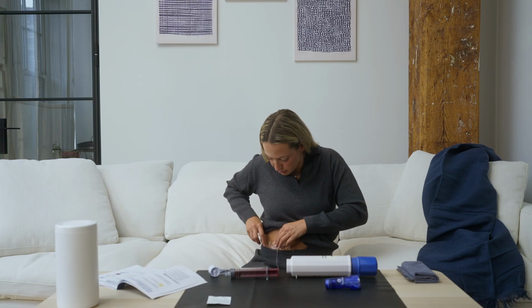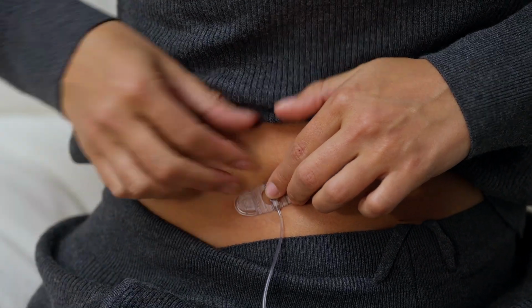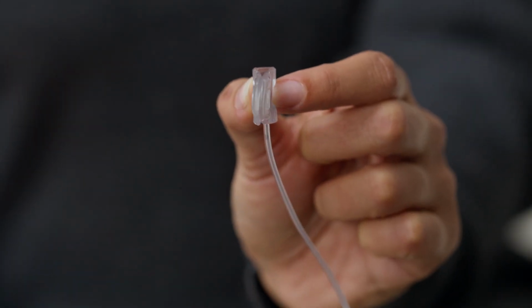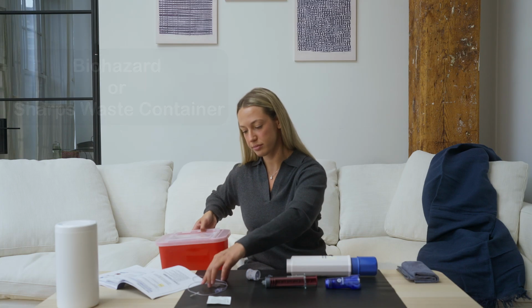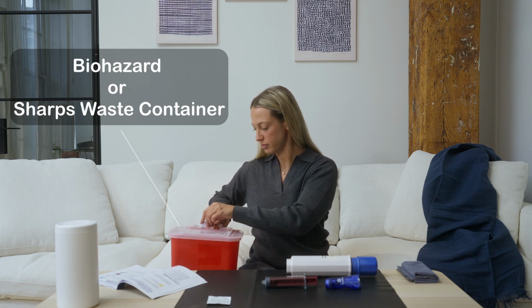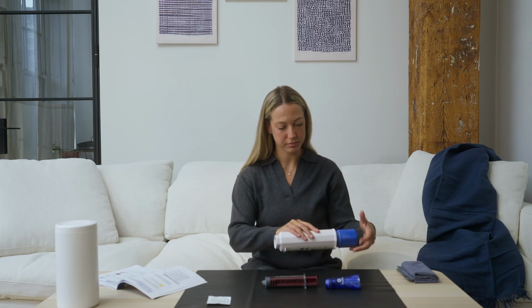Remove the soft site dressing and needle sets at a 90-degree angle or as directed by your healthcare professional, making sure to use the safety mechanism by pinching the wings shut. Dispose of all supplies, syringe, and needle sets in an appropriate biohazard or sharps waste container according to your local regulations.